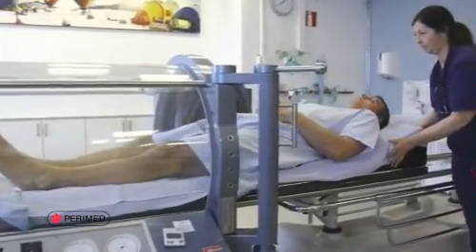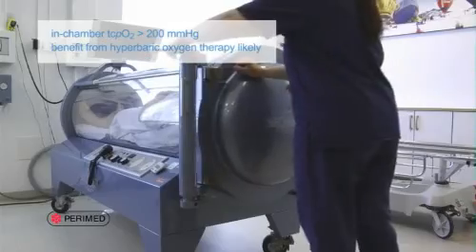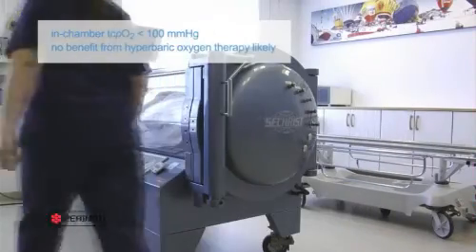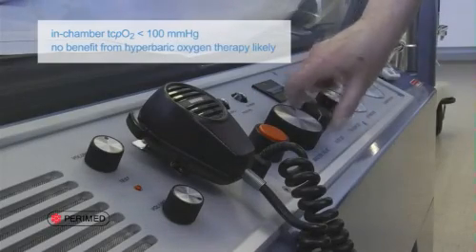If the in-chamber TCPO2 value is greater than 200 millimeters of mercury, this indicates that the patient is likely to heal with hyperbaric therapy. Conversely, in-chamber TCPO2 values less than 100 millimeters of mercury are closely associated with the failure of hyperbaric therapy. The in-chamber TCPO2 test is 75% accurate at predicting benefit from hyperbaric therapy. Although these data come from diabetic foot ulcer studies, they seem to apply to other types of wounds.